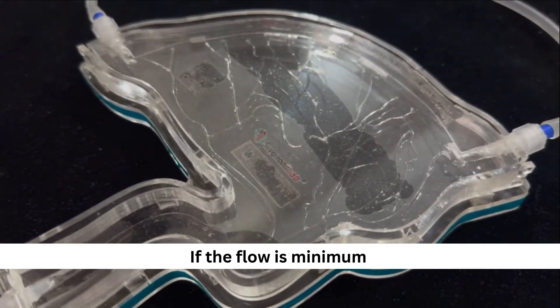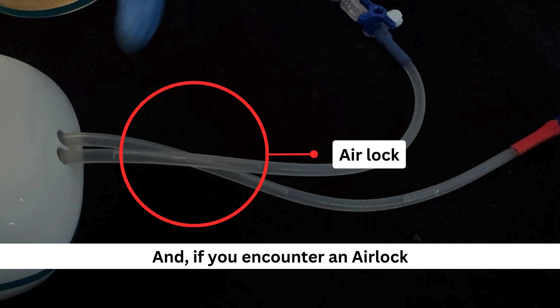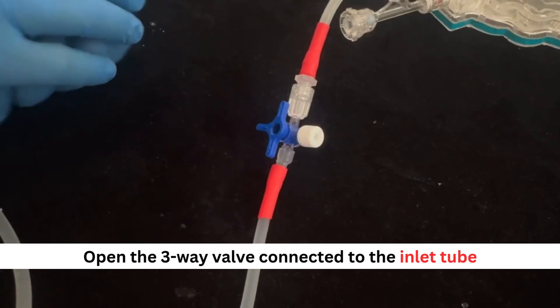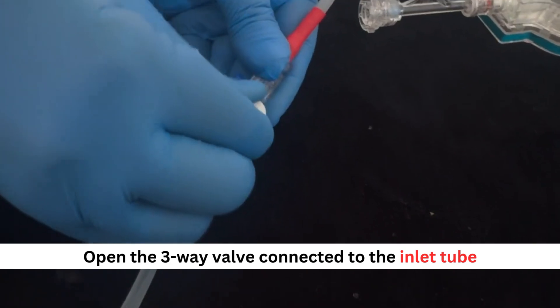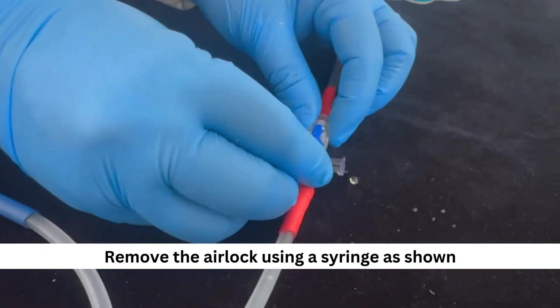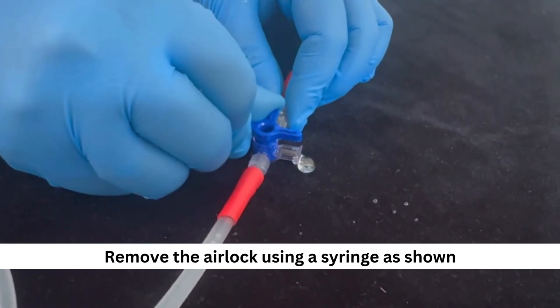If the flow is minimum, and if you encounter an airlock, open the three-way valve connected to the inlet tube. Remove the airlock using a syringe as shown.